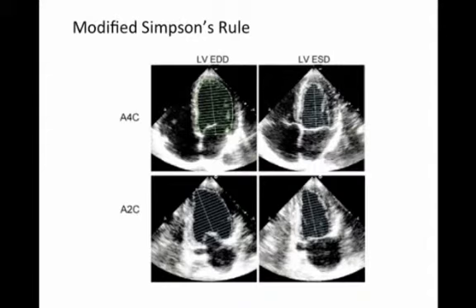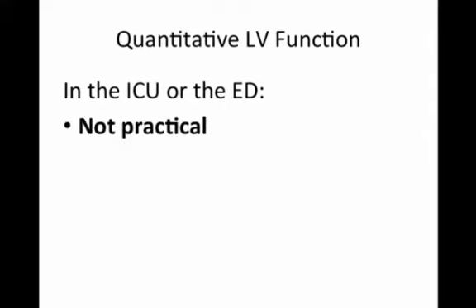That being said, I think what we'll say next may not shock you, and that is that quantitative LV function in the ED or in the ICU is neither practical nor is it necessary. Instead, the eyeball method is preferable.